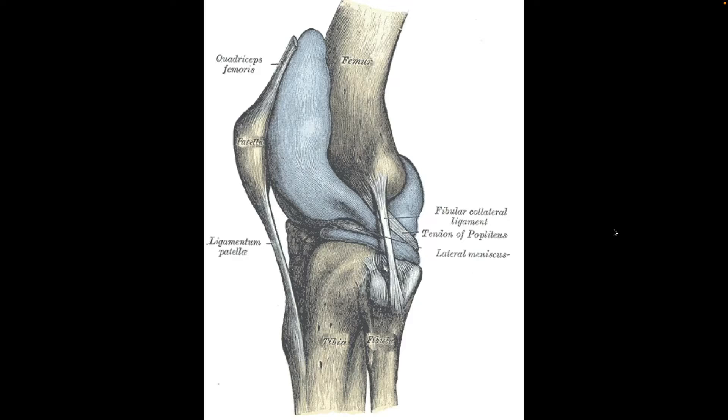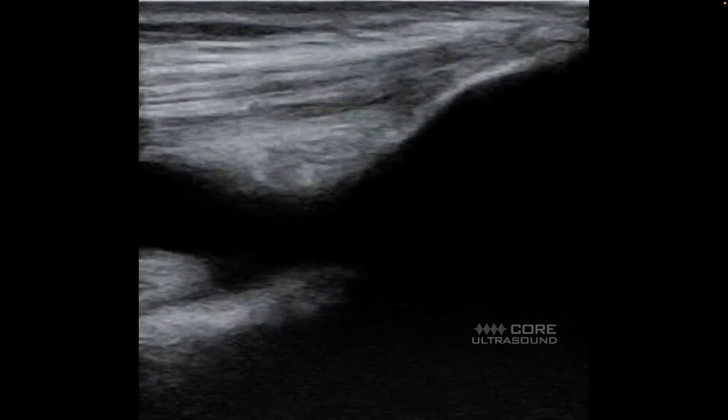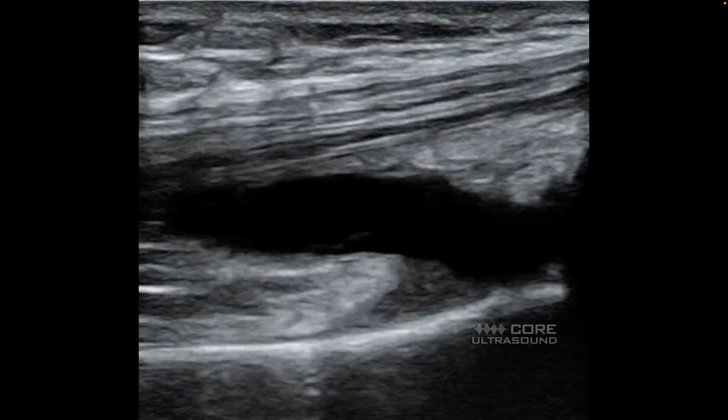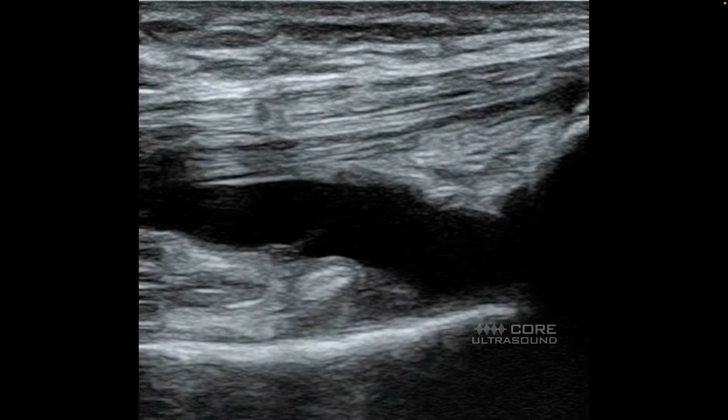With regards to the location where you're going to do this procedure, I generally go in the suprapatellar area. This is assuming that you've already diagnosed your effusion if you are going to do an aspiration, or the location at which you're going to do your injection if that's what you're going to do.